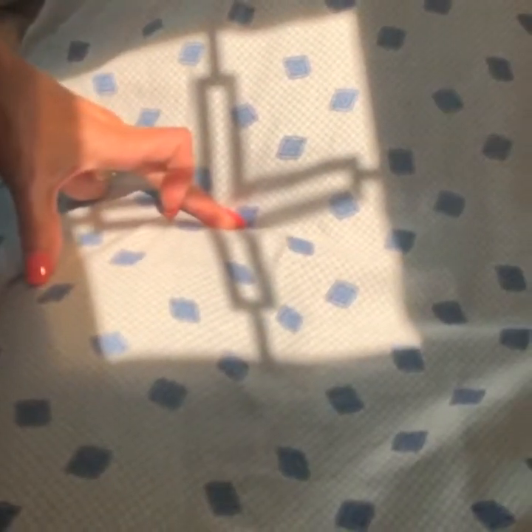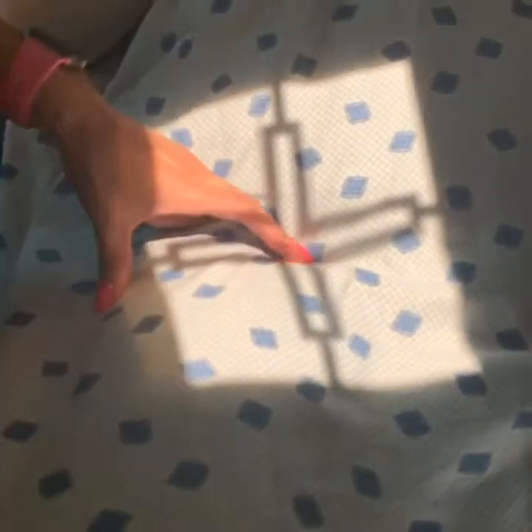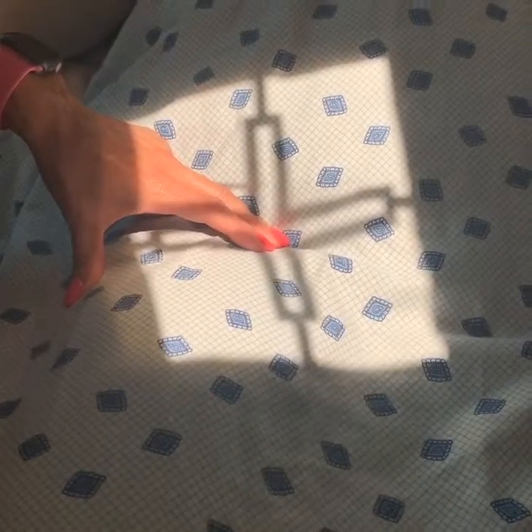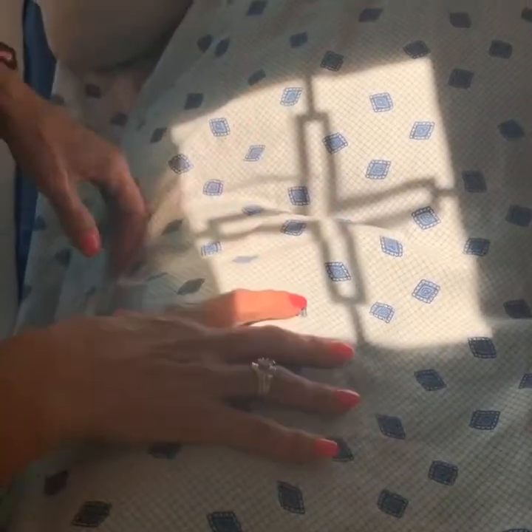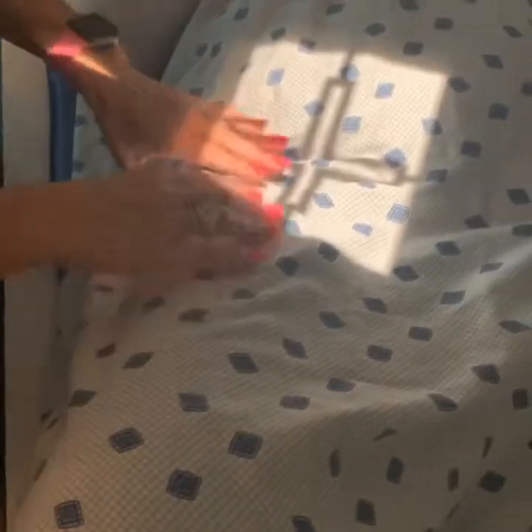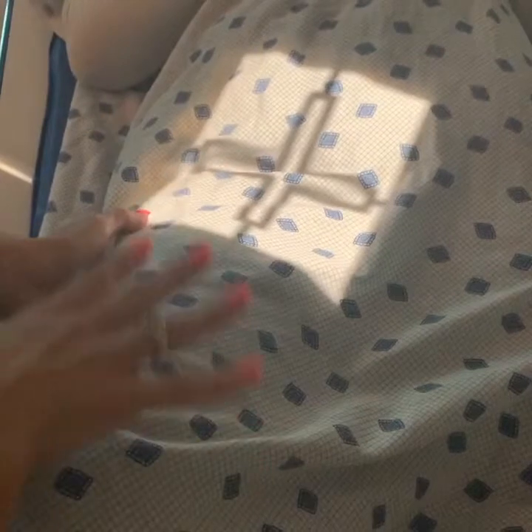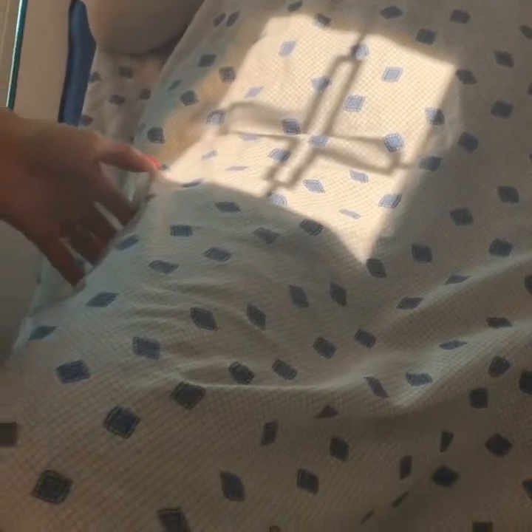Again, if I bend her, I'm right in the crease, which is typically a good cheat for you to know. If I bent her and my central ray was way up here or way down here, then I'd know I was nowhere near it. But you want about a 45-degree angle on that. And this is the one that typically when we do that, we can turn the tube head to run with the length of the femur. So her femur's like that, and this is running lengthwise with it. Does that make sense? Mm-hmm.